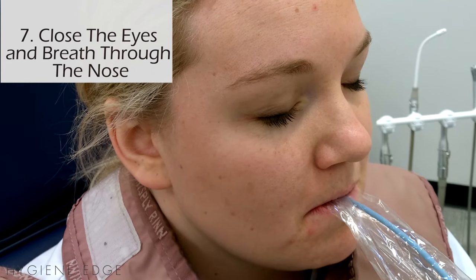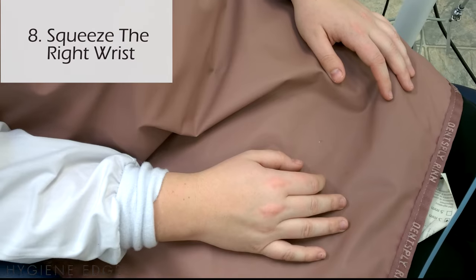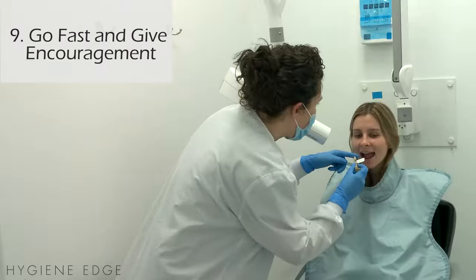Try having your patient close their eyes and take really deep breaths through the nose. Try having the patient use pressure points, squeezing their right wrist. This just helps them focus on something else other than the gagging.